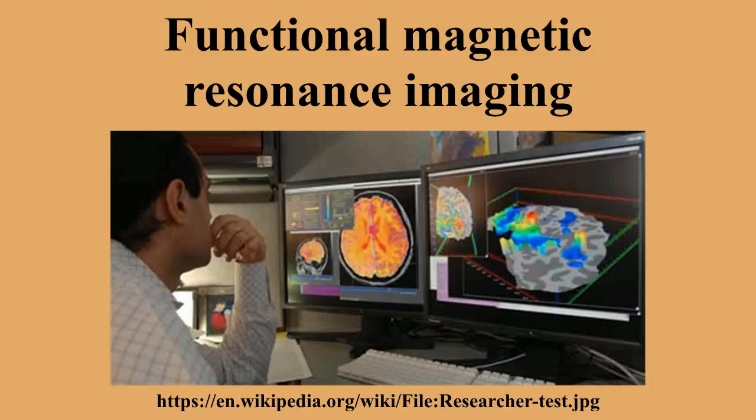The fMRI signal hence needs both a strong magnetic field and a pulse sequence such as EPI, which is sensitive to T2* contrast. The physiological blood flow response largely decides the temporal sensitivity, that is how accurately we can measure when neurons are active. In BOLD fMRI, the basic time resolution parameter is the TR, which dictates how often a particular brain slice is excited and allowed to lose its magnetization. TRs could vary from the very short to the very long.